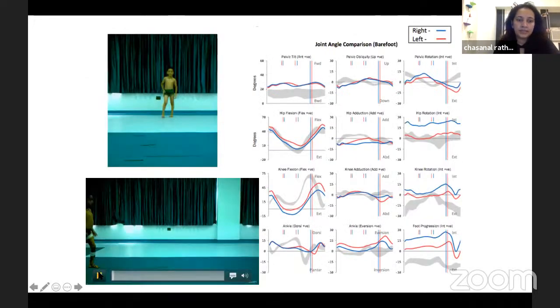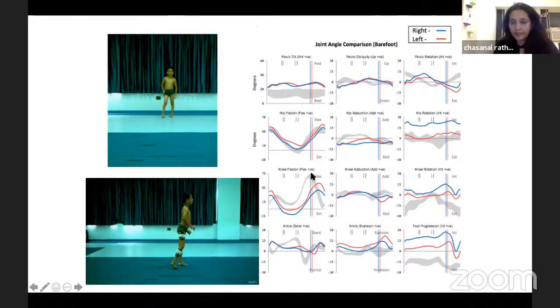So we see it is following the graphs very well. When we look at the knee, it starts with mild flexion and it goes into a recurvatum. And when we look again at the swing phase problems, we see that the swing phase graphs have the peak knee flexion not only decreased but also delayed. So this graph should have been here, but instead they are here, and plus they should have been here and they are again here. So this is what we are dealing with, a stiffening gait pattern.